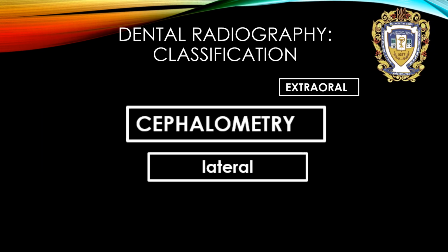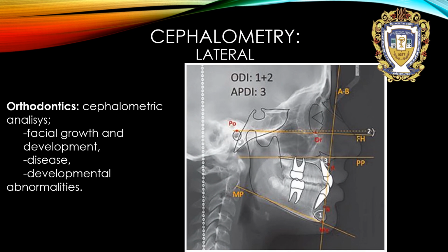Lateral cephalometry. Orthodontics aims cephalometric analysis, facial growth and development, disease and developmental abnormalities. Orthodontists use evaluation of lateral and frontal cephalometric X-rays to make diagnosis, to plan treatment, and to control duration and final results of treatment.